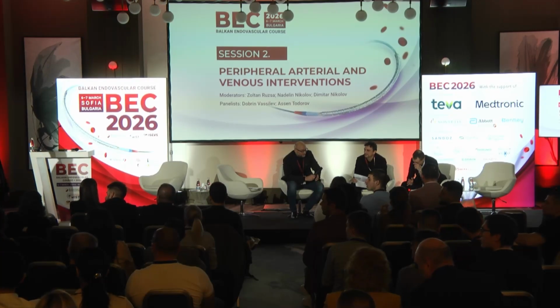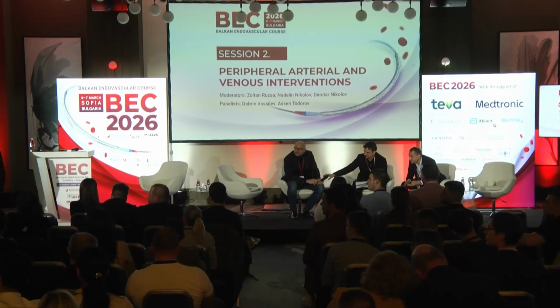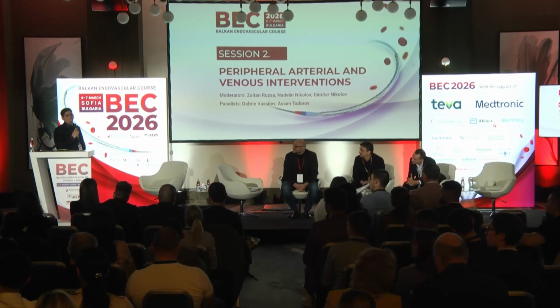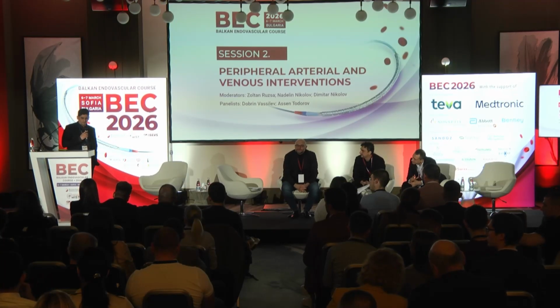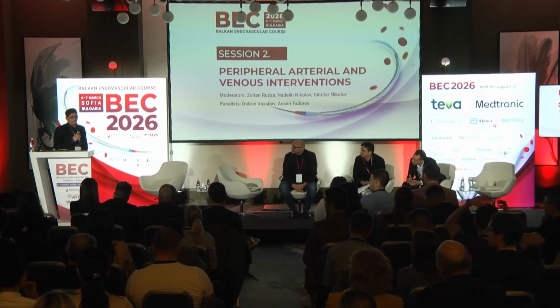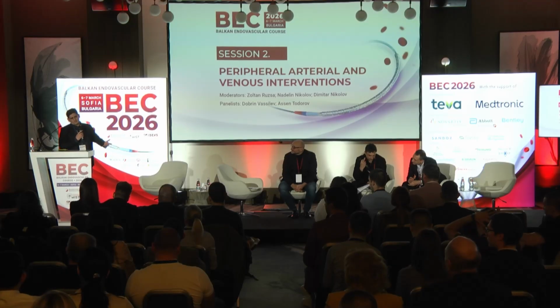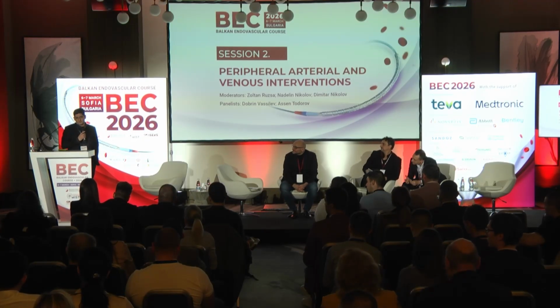So in case when you don't have any inflow, what do you do to keep your reconstruction patent? So there are cases with endophlebectomy. If you can do profunda, it will be okay. But you can go from the tibial vessels, and if there's an acute phase, you can do fibrinolysis and try to open the popliteal femoral vein.